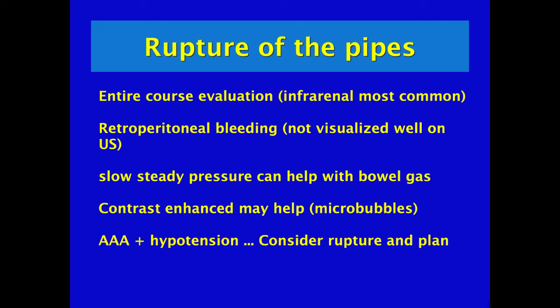Contrast enhanced may help. There are new studies using microbubbles, but we do not have that available at the bedside. And remember, if you diagnose an AAA and the patient is hypotensive, you must consider that rupture is part of your differential diagnosis and have a plan ready.